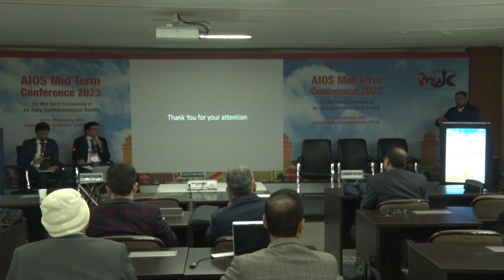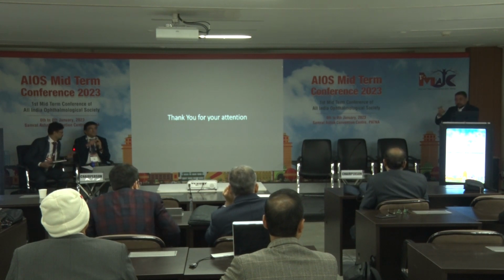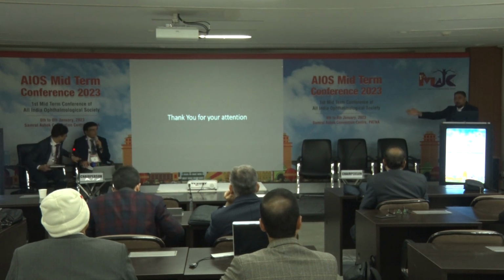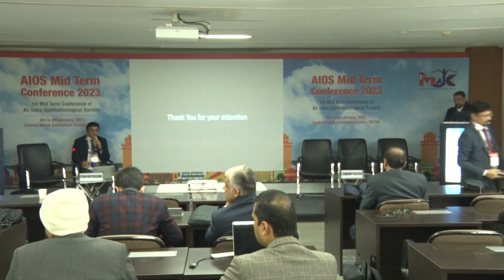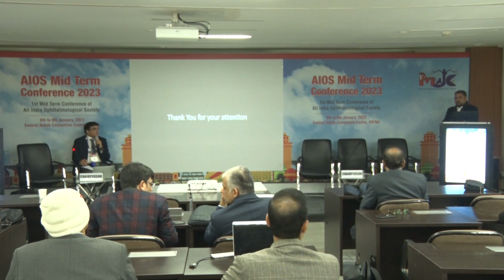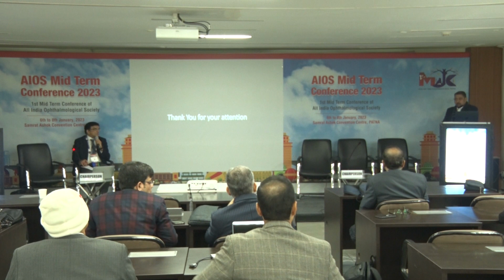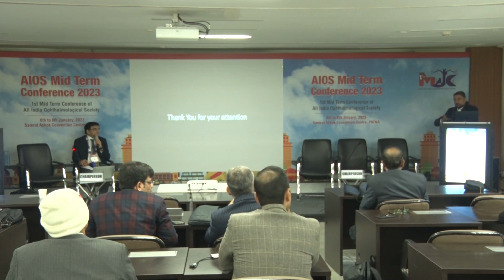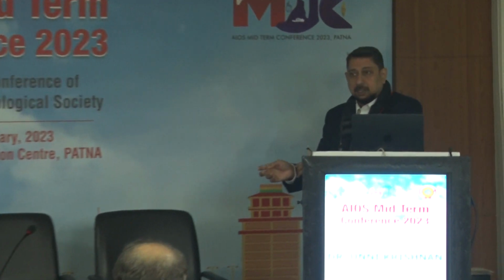That is, you may get a plane close to the visible white TRD, but that's not the plane where you pull. You have to go outside and bring it inside. That is the reason you don't get the edge. See, conventional tools we use, like forceps, are extremely bad. So that's why I have started using the pick, where it slices the membrane on one side also when you go. Or nowadays I'm a big fan of just using the suction of the cutter.